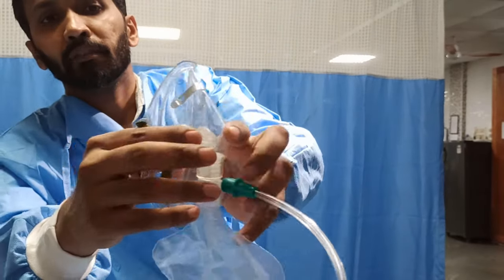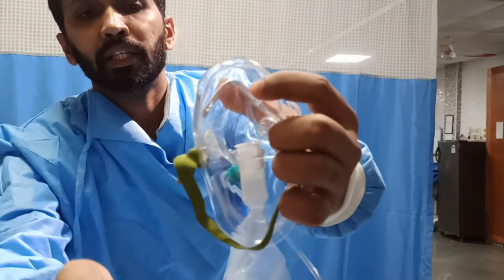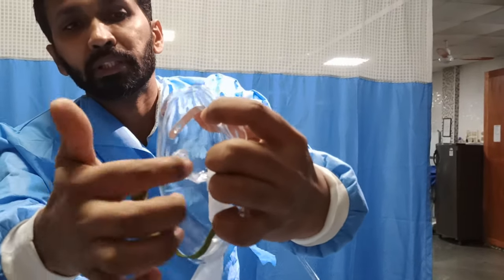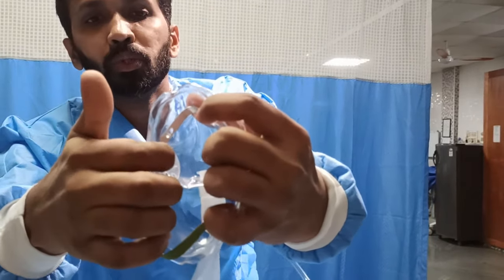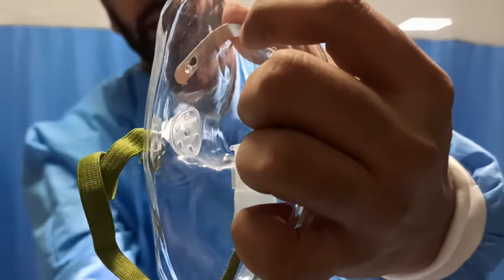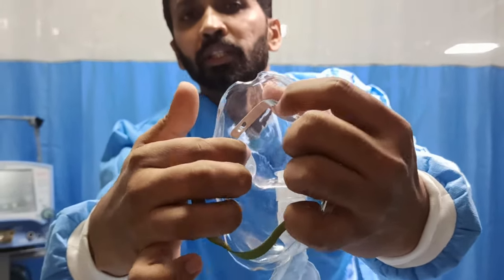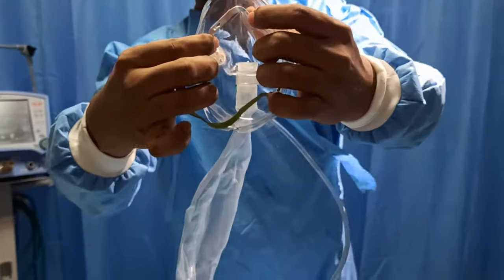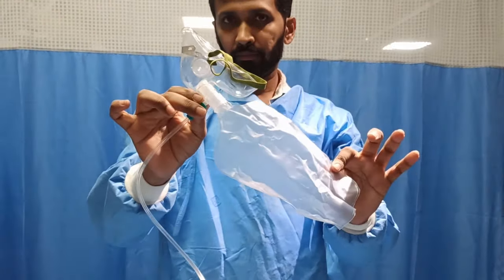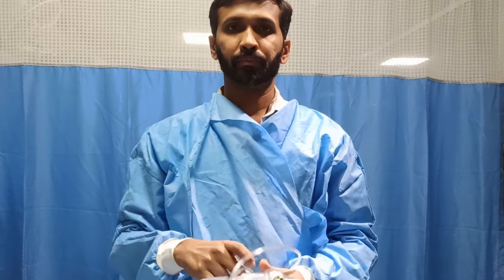After that, once the patient inspires, through a single-side valve, the oxygen comes from this reservoir to the patient. While the patient expires, the expiratory air goes through these holes, which have another one-way valve. So inspiratory oxygen comes from this reservoir and expiratory air goes through these expiratory holes. At least around 80 to 90% FiO2 can be maintained using the NRBM mask. These are the low flow devices that we use.